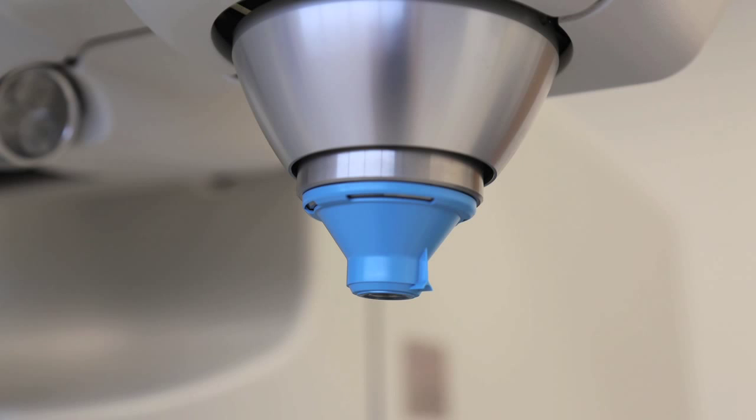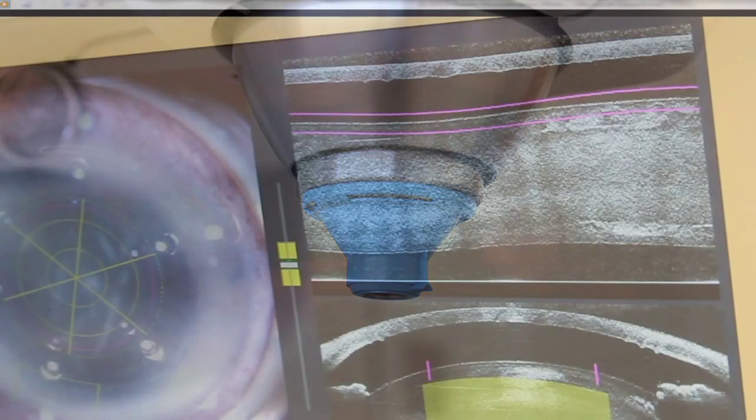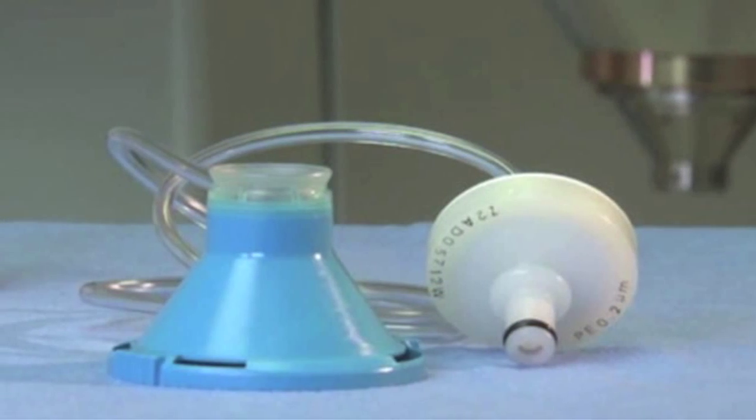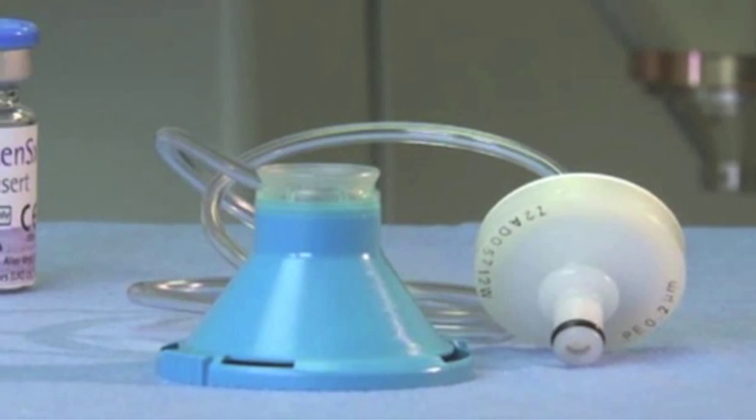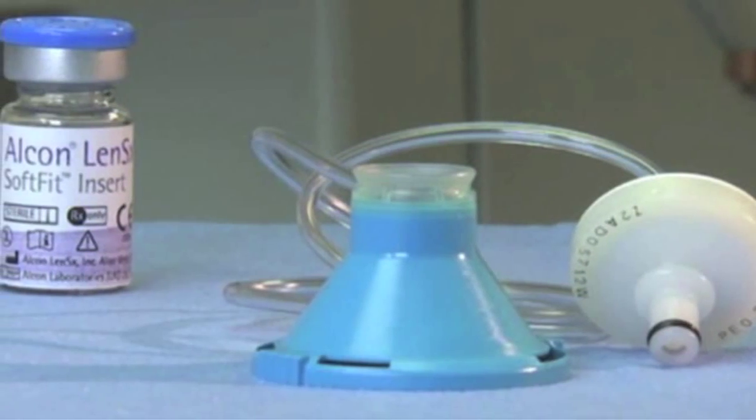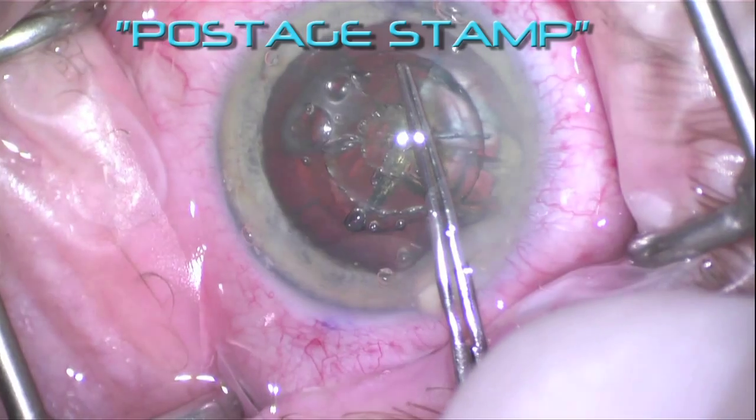While earlier versions of the Alcon LensX utilized a hard docking mechanism with corneal applanation and subsequent flattening with distortion of the cornea, with folds and ridges as previously shown, newer versions utilizing the soft fit interface are expected to decrease this distortion and have already been seen to improve the quality of the capsulotomy. Less corneal distortion simply means greater ability of the laser beam path to reach its intended target.